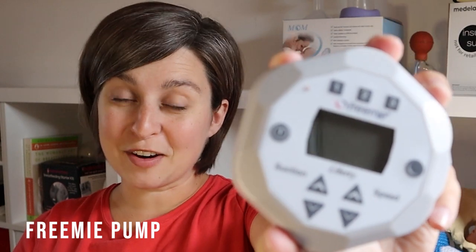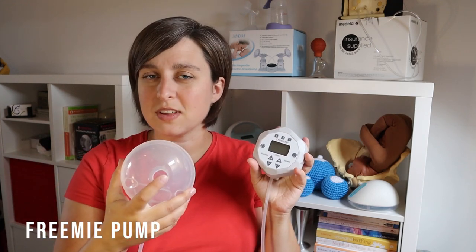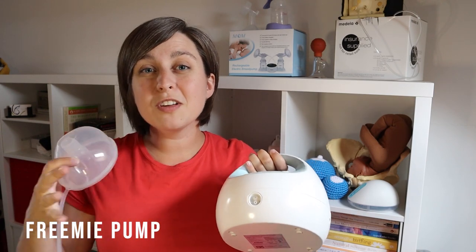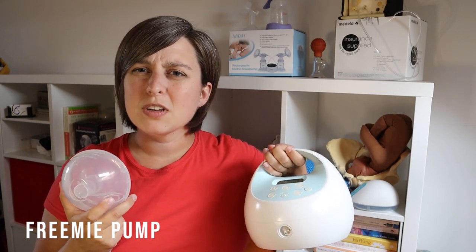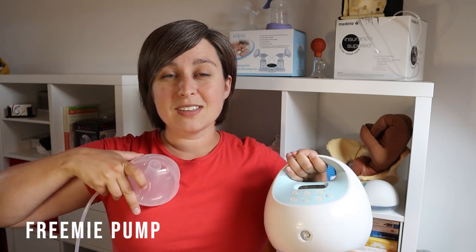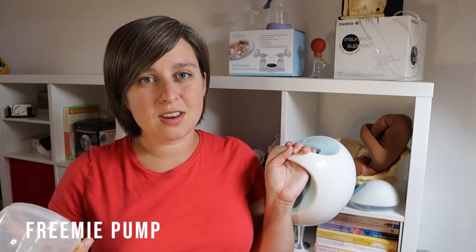Now I'm going to tell you some features I like and dislike about each pump, starting with the Free Me. This is a pretty good little pump and you can buy the entire Free Me system — it comes with two cups. Or you can just buy the cups, which is a little bit cheaper, and hook them to your traditional pump. So you don't have those big awkward flanges but you can still use your existing pump motor. A lot of women like to do this while driving. It works with Spectra, Medela, and all those popular brands.